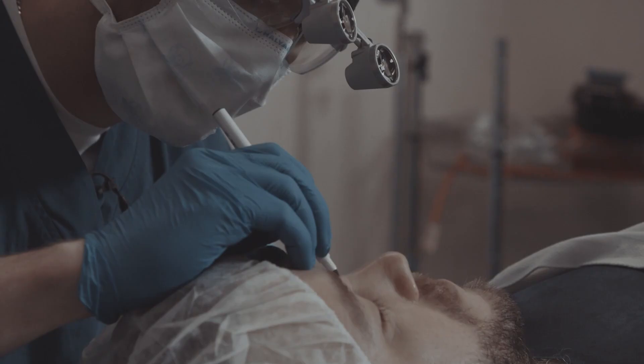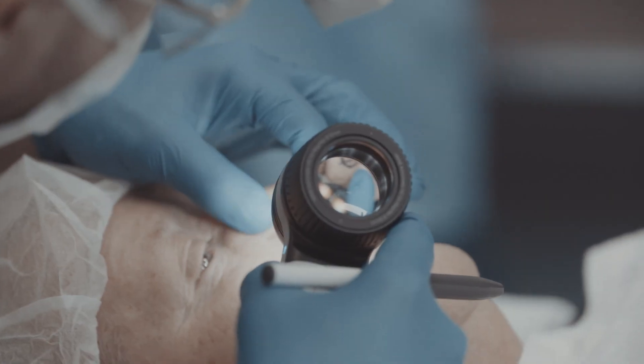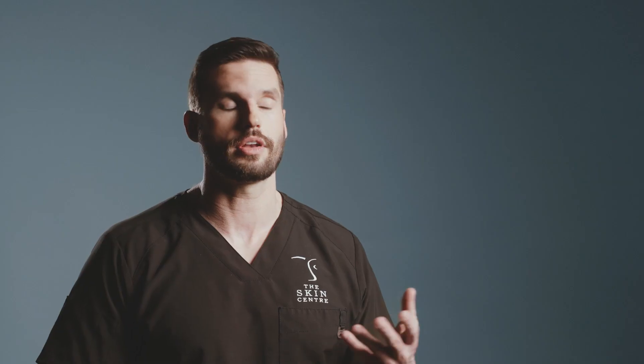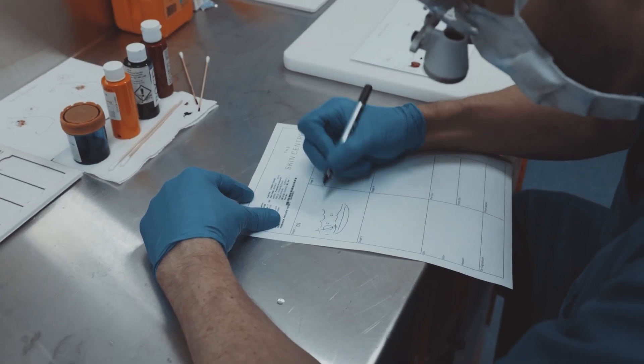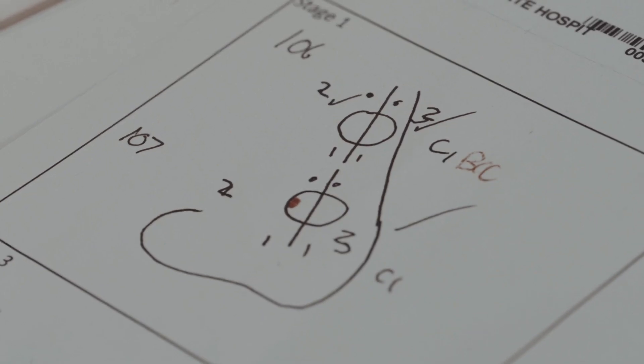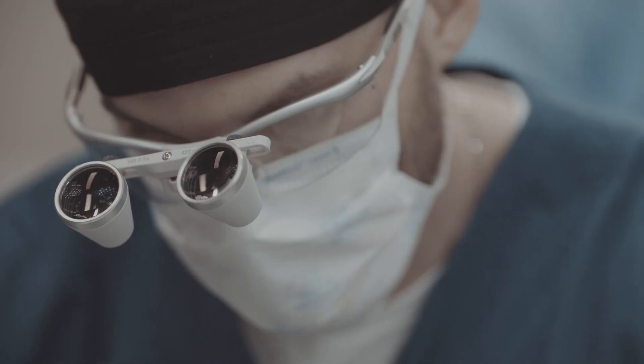The process of Mohs micrographic surgery begins by marking out the tumour on the patient's skin. We use our clinical skills as dermatologists and aids such as dermoscopy and magnification to identify where the skin cancer is beginning and where it may have grown to. We then create an illustration — a representative map — so that in the laboratory we can remain orientated in the patient's tissue, ensuring we've removed the skin cancer or, if still present, identifying exactly where it is.